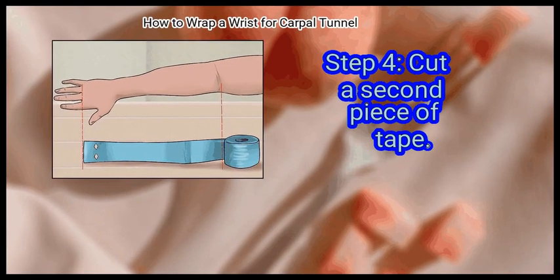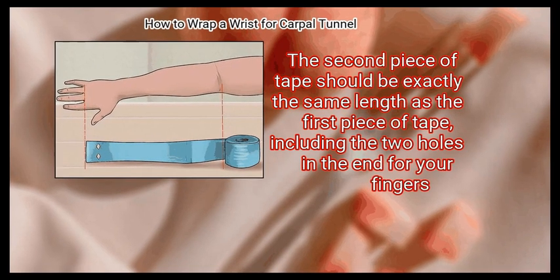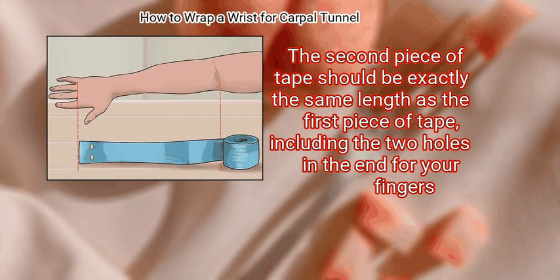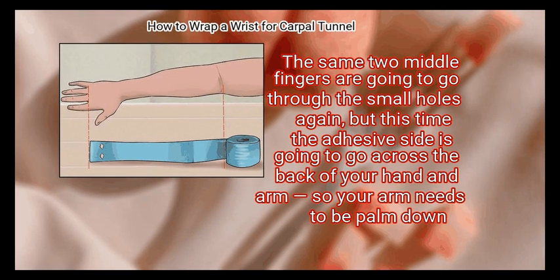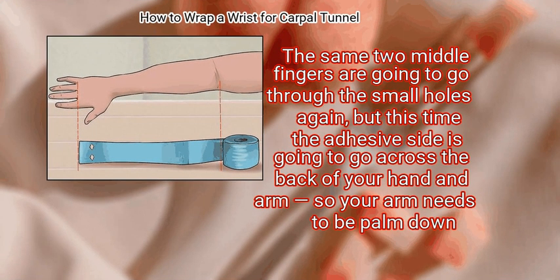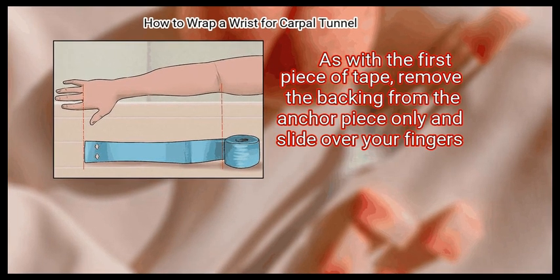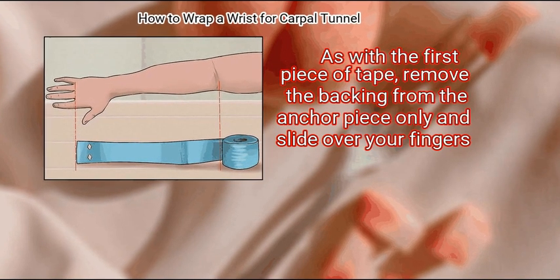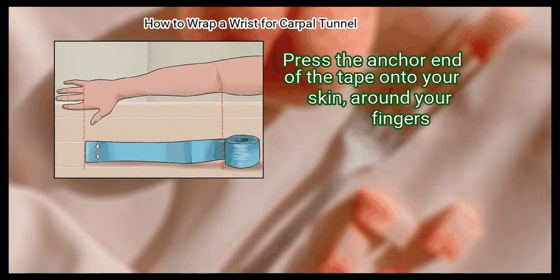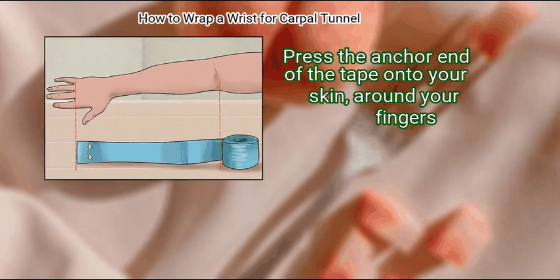Step 4. Cut a second piece of tape. The second piece of tape should be exactly the same length as the first piece of tape, including the 2 holes in the end for your fingers. The same 2 middle fingers are going to go through the small holes again, but this time the adhesive side is going to go across the back of your hand and arm. So your arm needs to be palm down. As with the first piece of tape, remove the backing from the anchor piece only and slide over your fingers. Press the anchor end of the tape onto your skin, around your fingers.